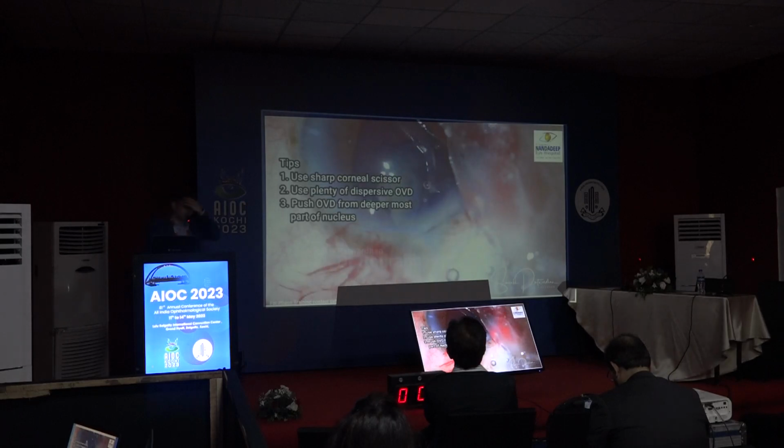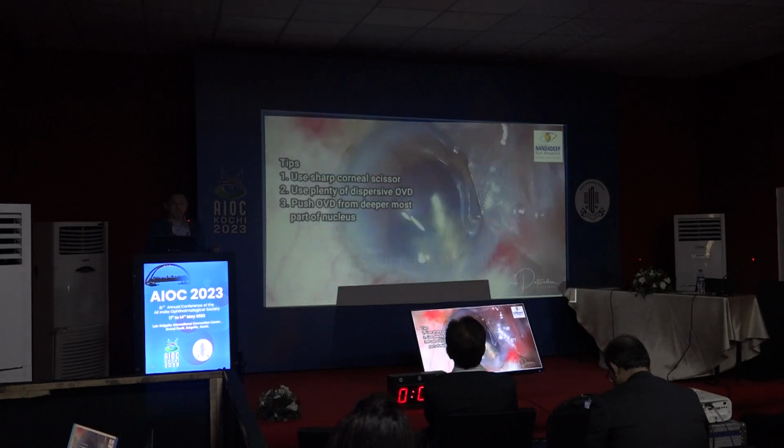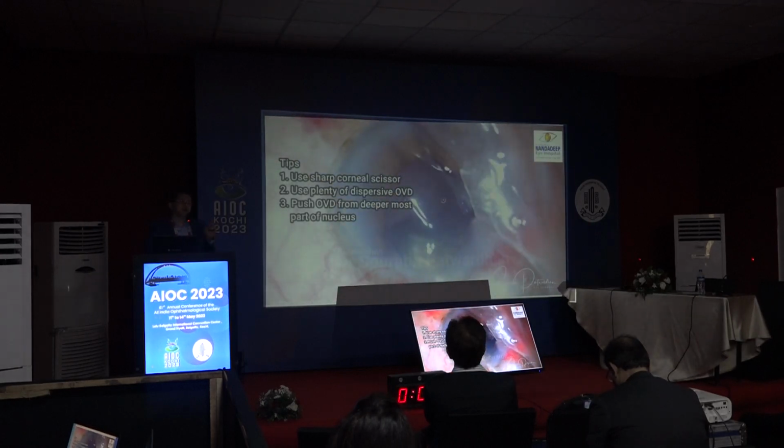Now, in order to remove the nucleus, the most important tip to understand is that you should always push OVD from the deepest part of the nucleus. This, I think, I will emphasize again in another video. This is a commonly made mistake by surgeons.